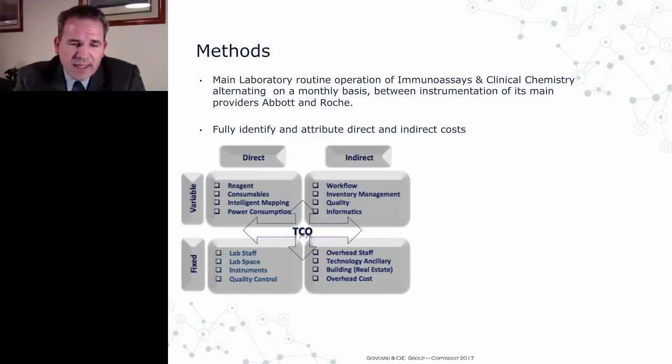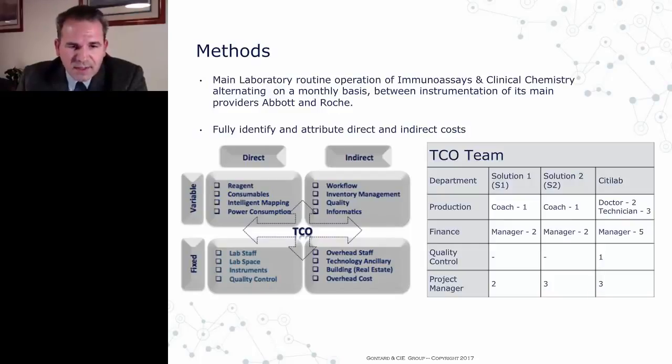And we calculated everything. We extracted data, and we had people on the production floor from both suppliers with stopwatches, with cameras, and we shared the LIS information, we shared the middleware information with everybody, and we really did a scientific methodological approach towards our costing.